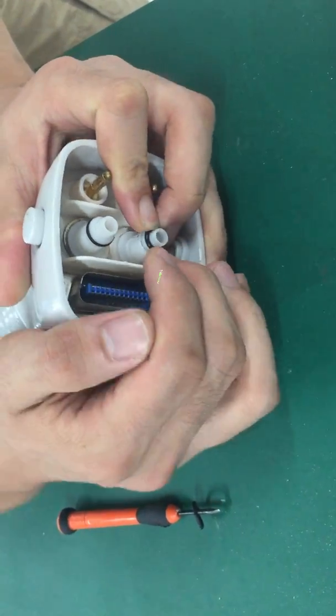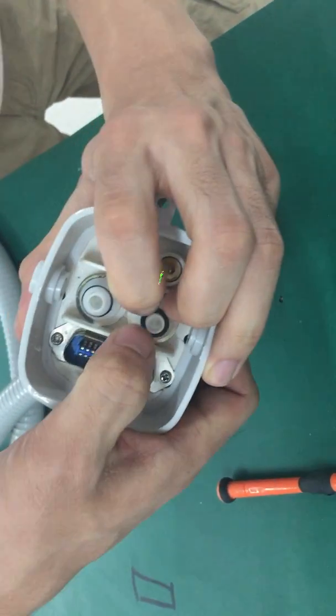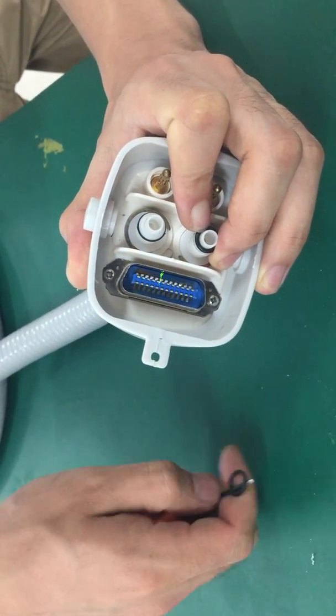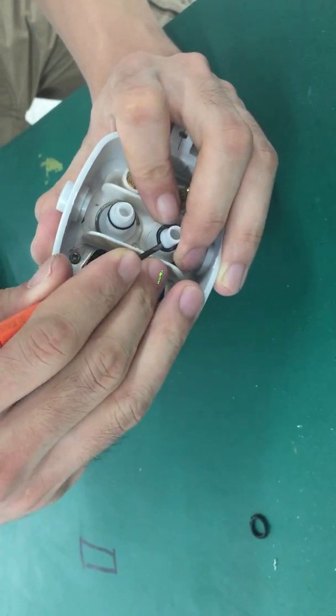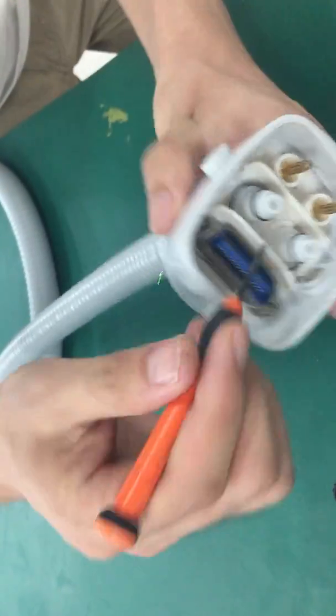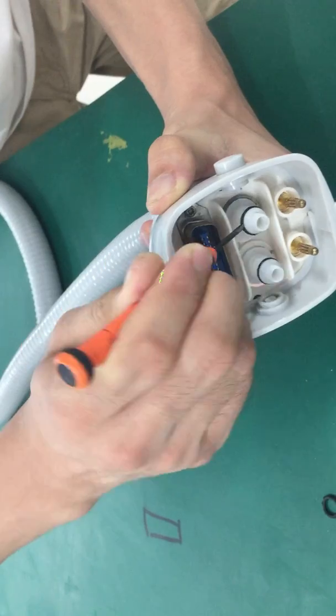Just pull it. Back there. Like this. You should change both of the rubber rings.